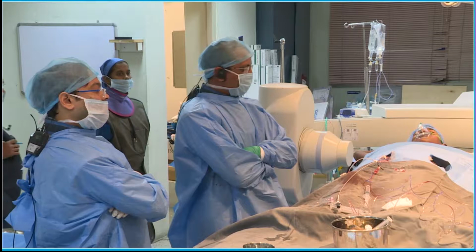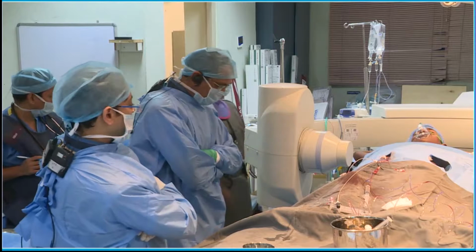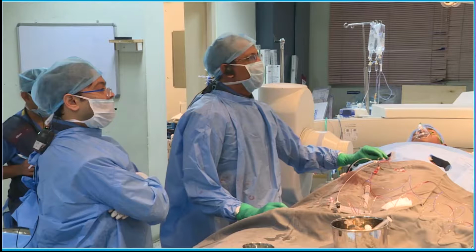Okay, so one comment is a small PDA you don't need to wait and a large PDA you need to wait. That is one comment from the audience. Any more comments? Yeah, we can go for the lecture while we're waiting. This reminds me of my EP colleagues, who do the ablation and wait for 15 minutes or something to see whether tachycardia returns.